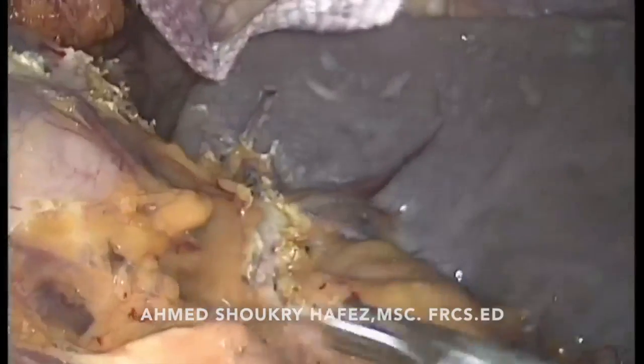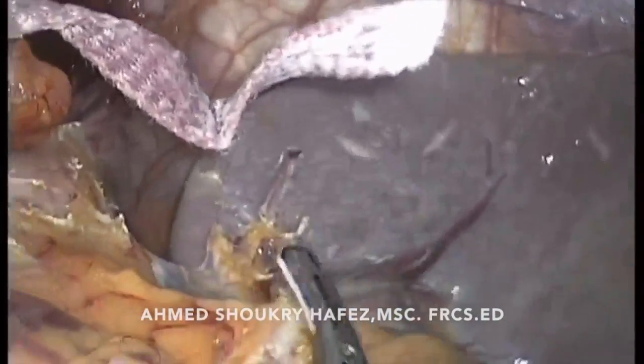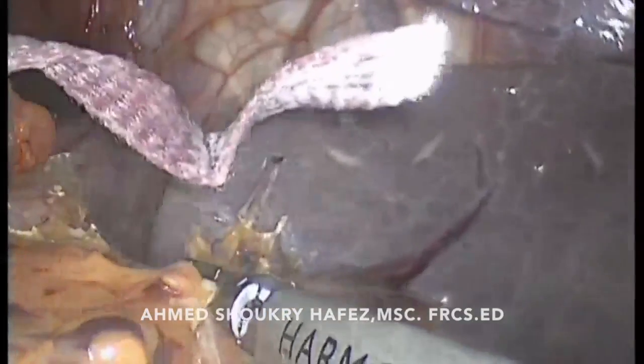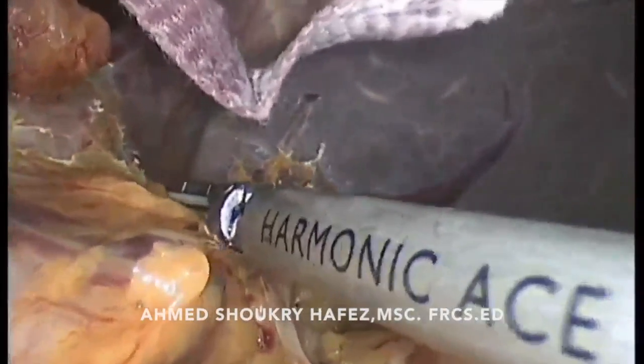All posterior attachments must be taken down. The retrogastric tunnel must be completely free to accommodate the wrap, so as not to cause dysphagia postoperatively. And because this patient is very thin, you should be very careful, as the splenic artery usually lies closer than what you think, and you can injure it if you're not careful enough.